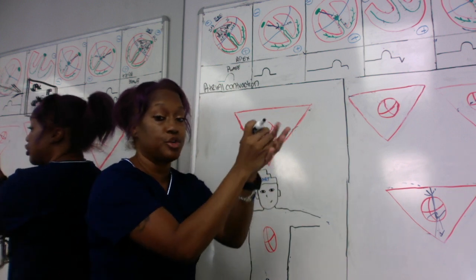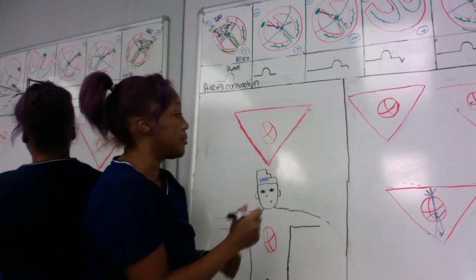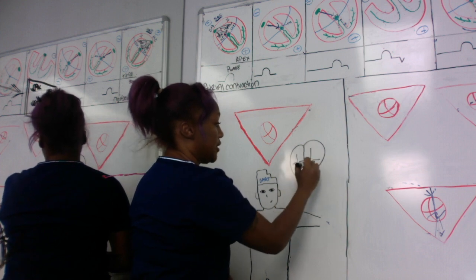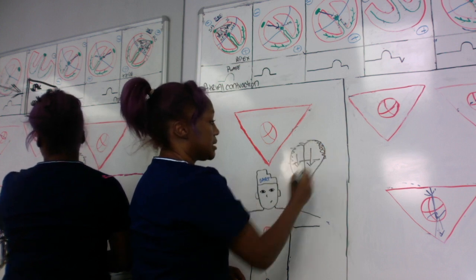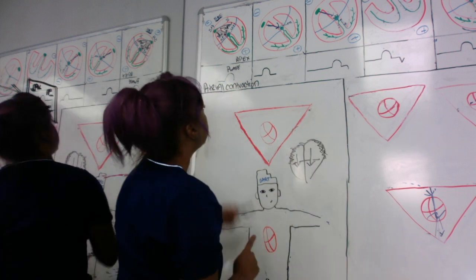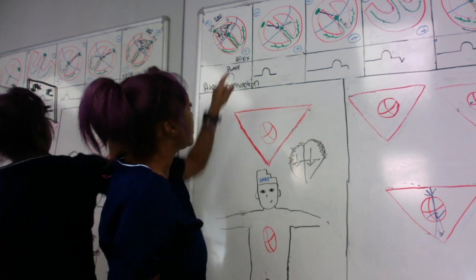It's not relaxing, it's working, it's contracting. So what happens when you squeeze a sponge? All the water comes out. So when the atria are squeezing, it's pumping that blood where? That's right, into the ventricles. Squeezing. This is my squeeze mode here. The heart is working. P wave, atria are squeezing. They are working. Which represents a positive deflection because the impulse is traveling towards the positive electrode.